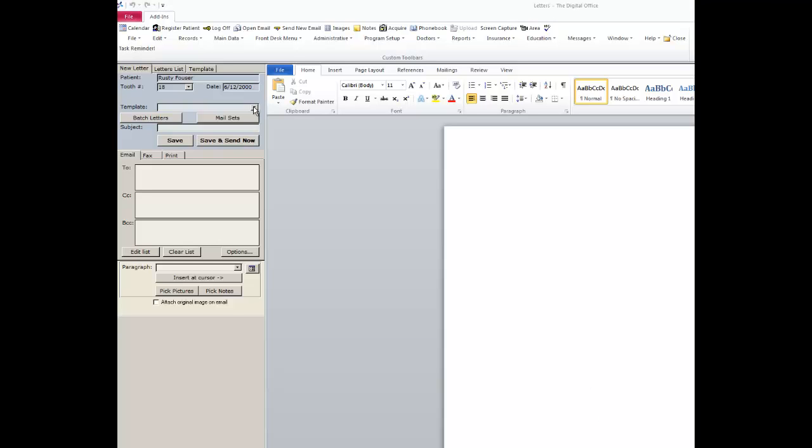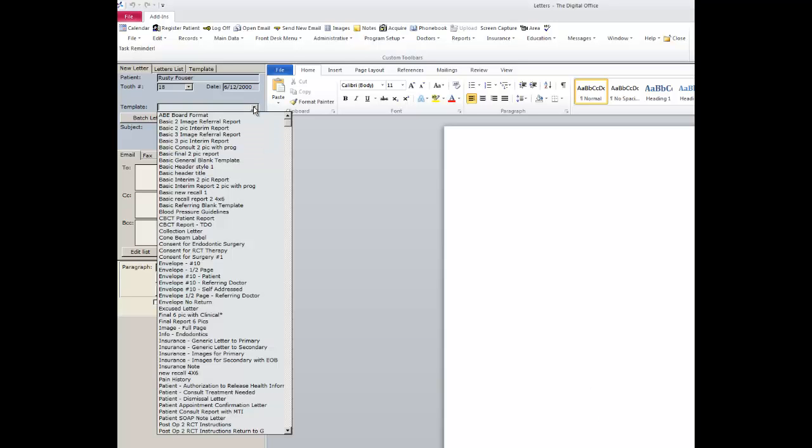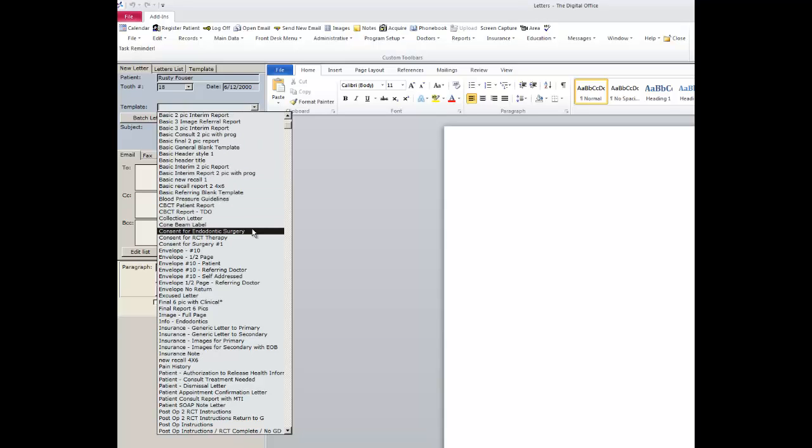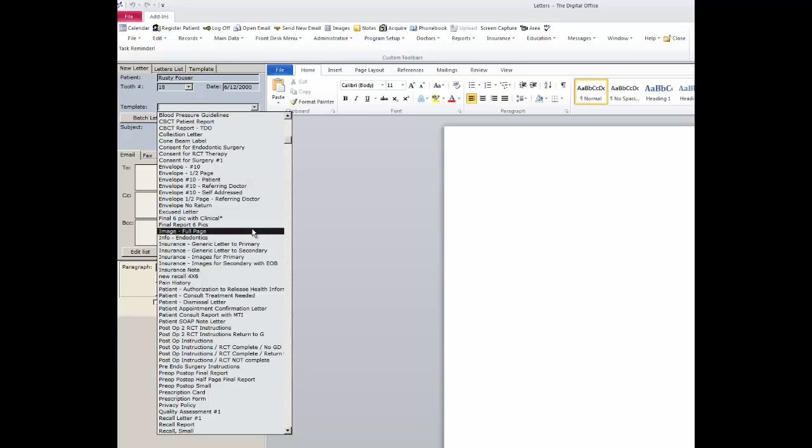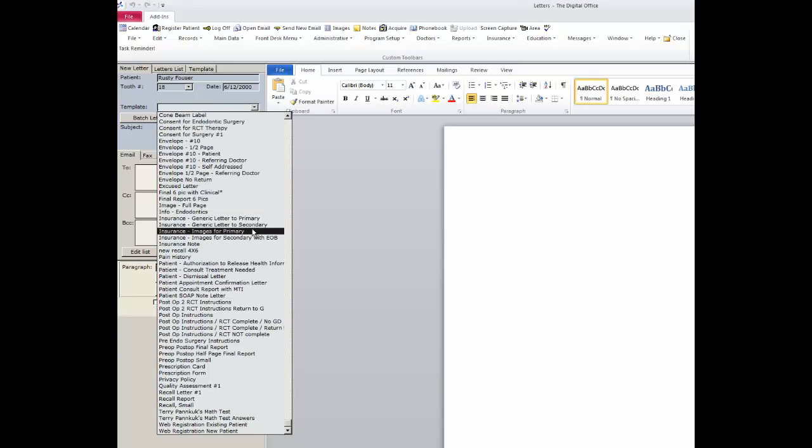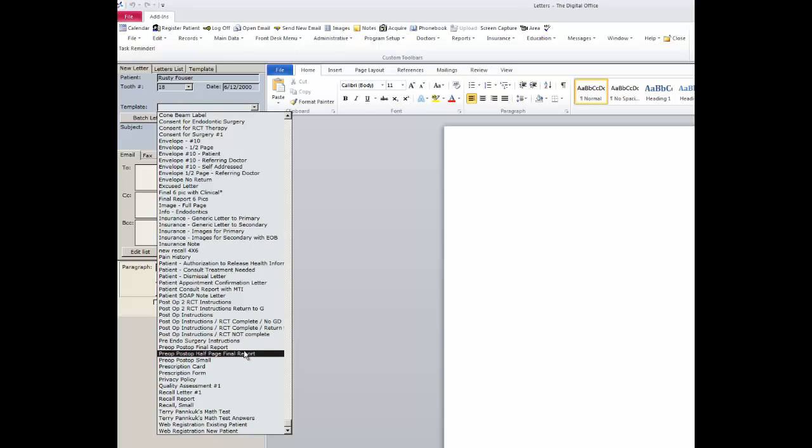The TDO letters module comes installed with many templates that you can use as they are or you can customize them to add additional features that you wish for your reports. Let's take for example a standard half-page pre and post-op referral report.